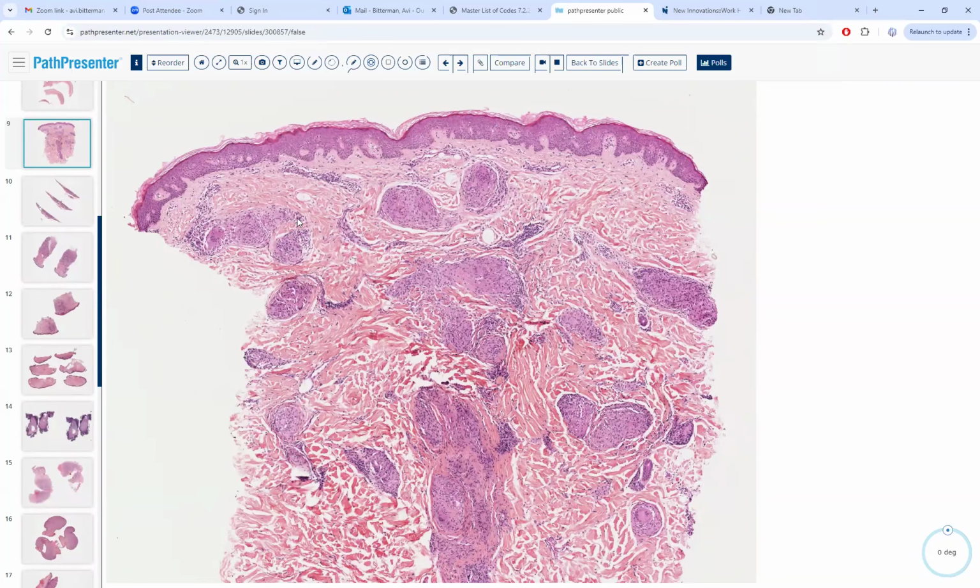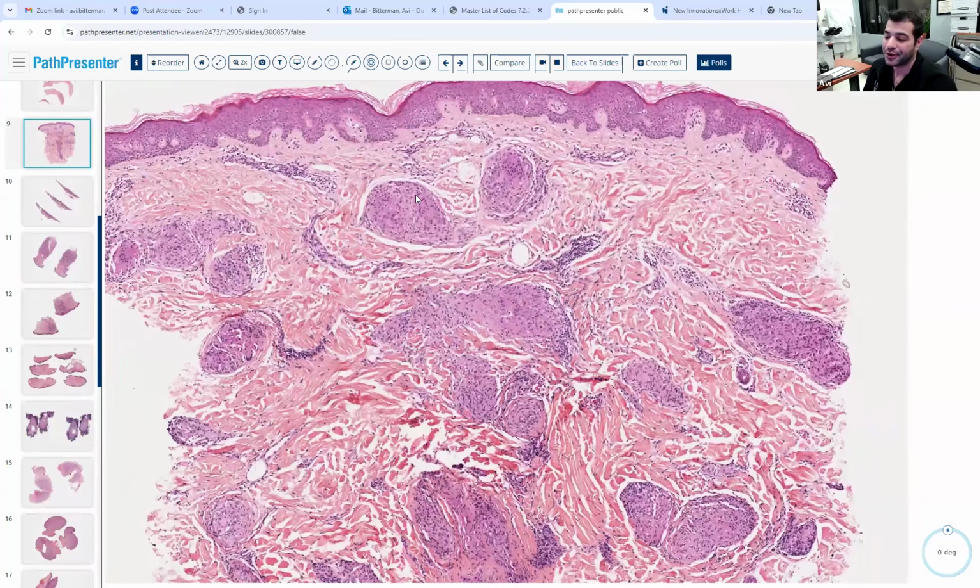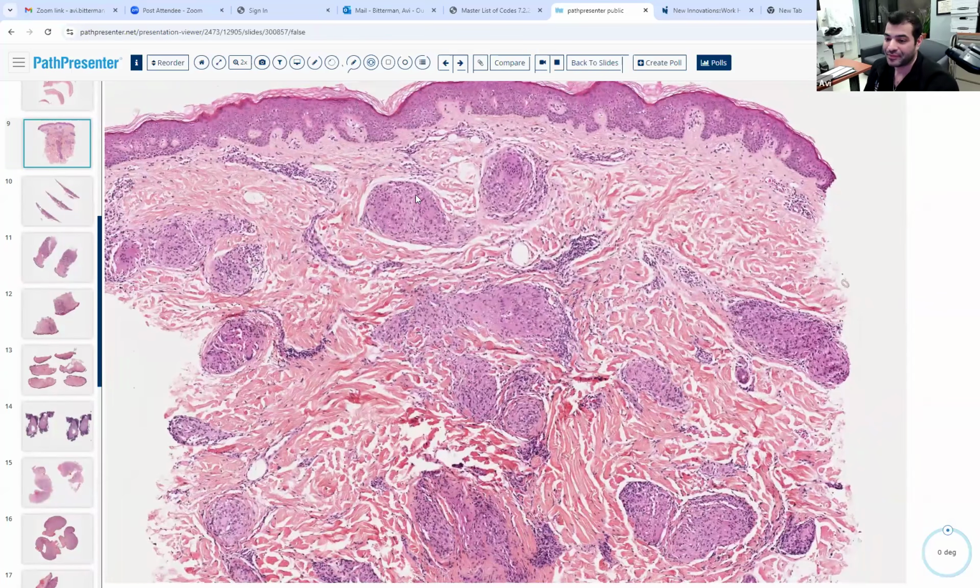Silicosis, zirconium, zinc. Can it be tattoo? Pigment? You can get granulomatous tattoo reactions. They're not always granulomatous, they're not always sarcoidal granulomatous. But you can get that, yes.